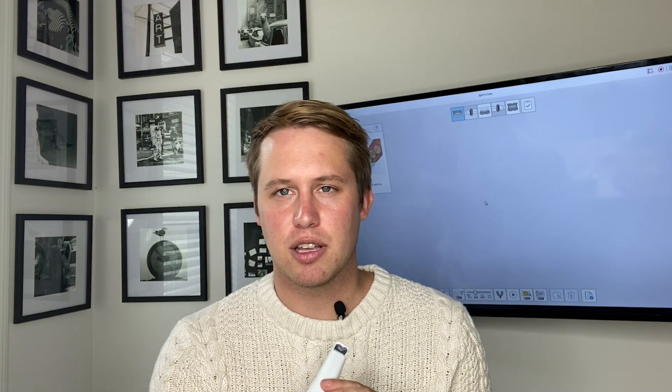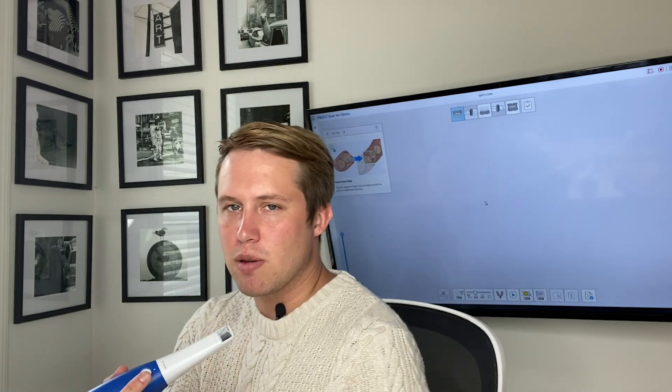Enough about the features though — I want to start scanning intraorally for the very first time after I've unboxed my i600. Granted, I'm in a swivel chair, not a dental chair, so bear with me for the first time scanning here with the i600. We'll see how this goes.